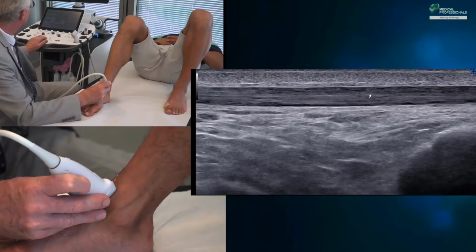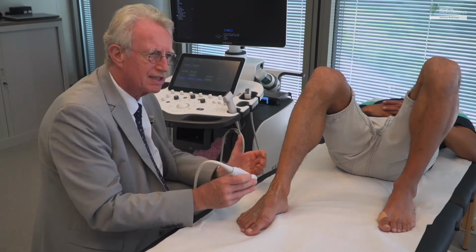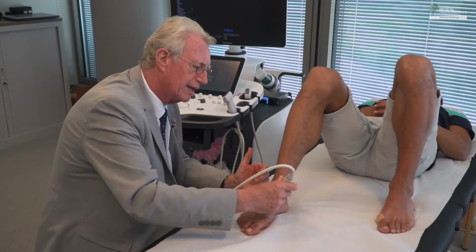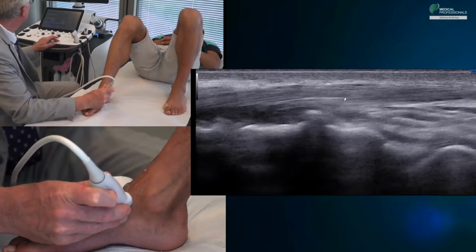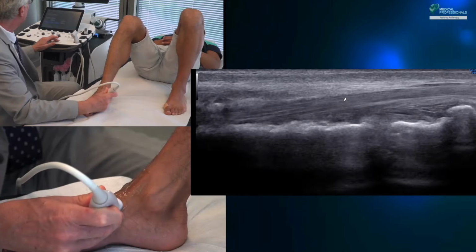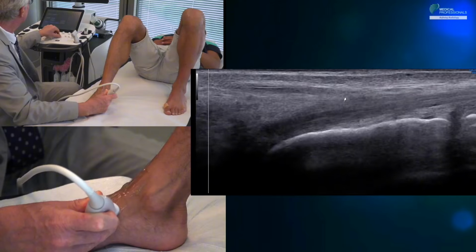The patient does not come in for a rupture or pain, but for a mass syndrome located on the anterior medial side of the ankle. This is the first pathology of this anterior tibial tendon. The second pathology is also a trap because it involves the insertion of the anterior tibial tendon on the cuneiform. We start from a place where we can easily see the tendon and slowly descend to its attachment on the wedge. In fact, the tendon is bifid at this location, but on ultrasound, it's difficult to separate the 2 portions.